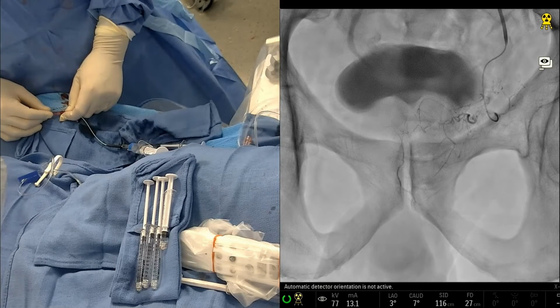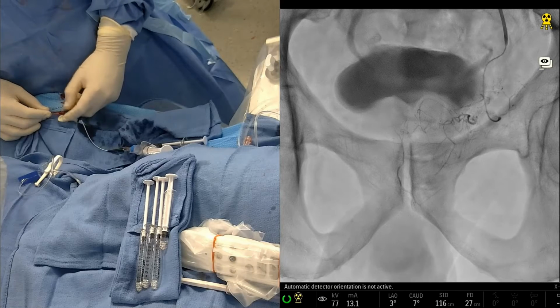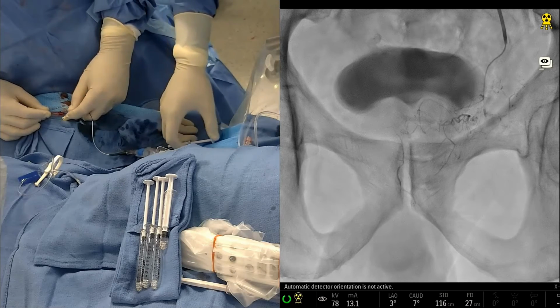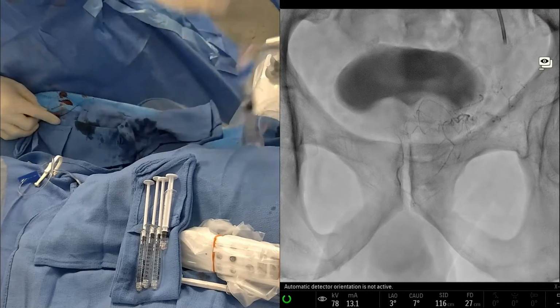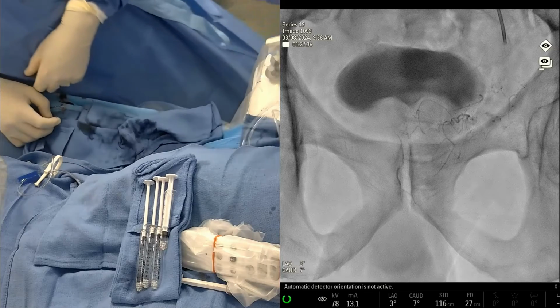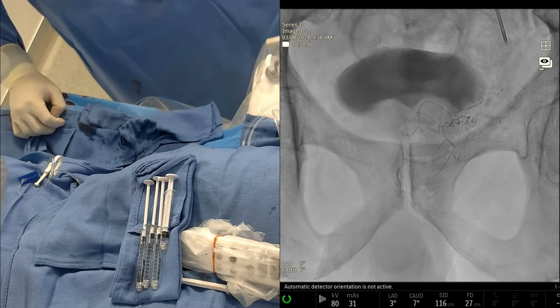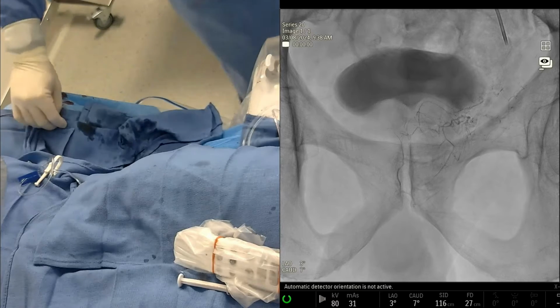So I just took the balloon down, so now we have forward flow, but the vessel's probably occluded at this point. And that's it. The other thing we could do is drop a little bit of glue here just to form a little proximal plug, just a tiny bit, very slow. That's it. And then the other thing that we're seeing here is the amount of time that you have. A lot of people inject the glue and just rip the catheter out. It really shows that with this mix, you have time to be patient and thoughtful about how you're doing the embolization.